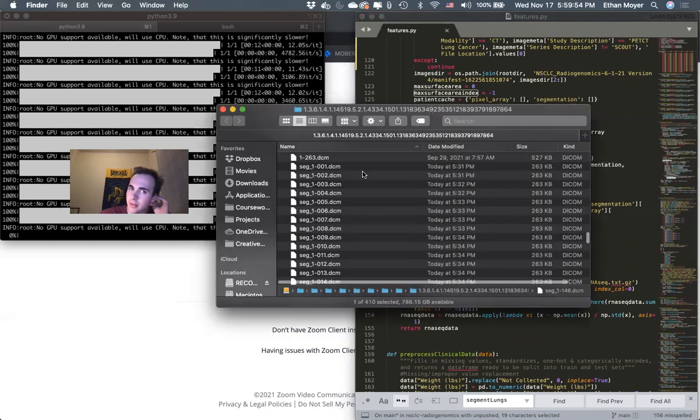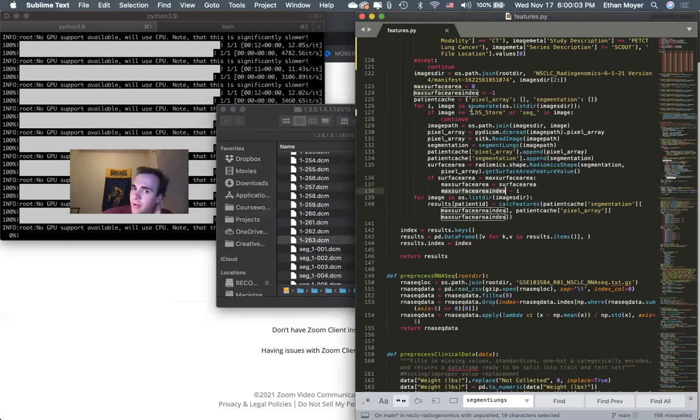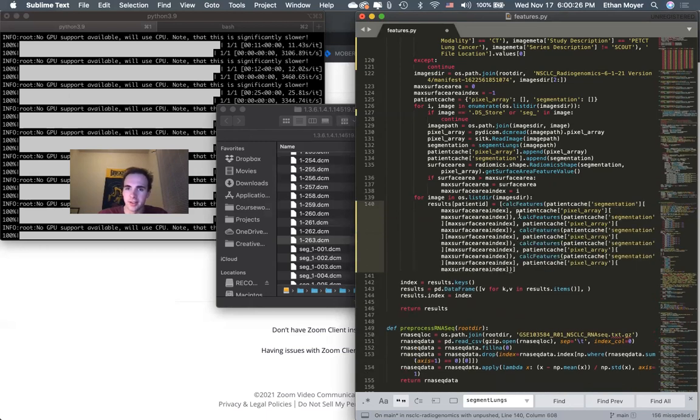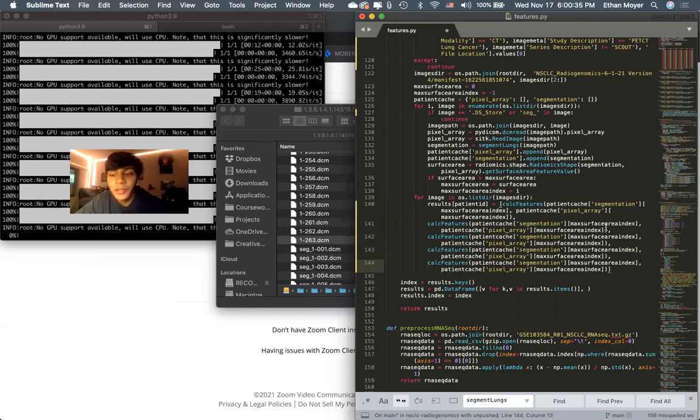When I tried it the first time, it identified the maximum at like 160, and it's 260 in total, so it was about midway. What we need to do is calculate features for the middle 5. I can just hard code that in right now. I think that's pretty easy for us to do, and I don't think we need more than that. I'm just hoping that DenseNets work out.